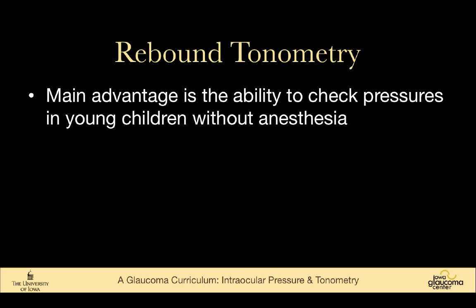The major advantage of rebound tonometry is the ability to check pressures in young children without giving them a drop of anesthesia. And this has really been transformational in terms of the number of times we have to take children back for exams under anesthesia, because the children that we couldn't do Tonopen or applanation tonometry on, often we can use rebound tonometry.